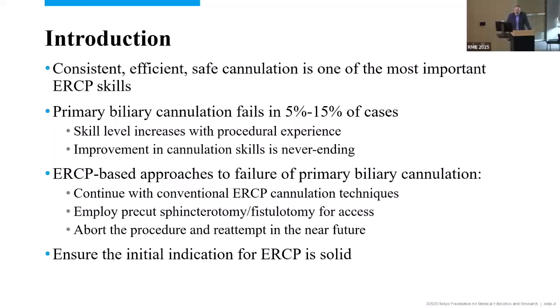And you have to make sure that moving forward in those situations is the right thing for the patient. It's also at this stage that I think you need to be thinking, if you haven't already, about how you're going to manage the risk for post-ERCP pancreatitis. Are you already intraprocedurally giving fluid to the patient at a reasonable volume? Have you given rectal diclofenac or rectal indomethacin? Is your plan to place a pancreatic stent if you have access? That, at this point, needs to be part of the algorithm and needs to be part of your thought process.